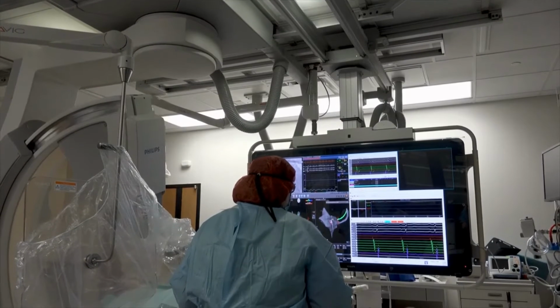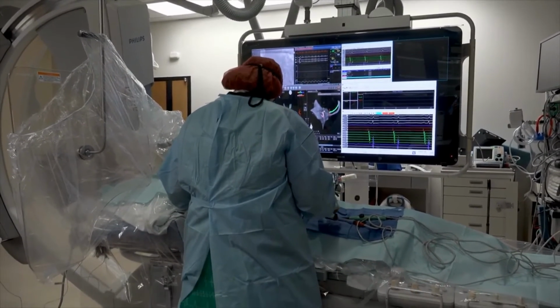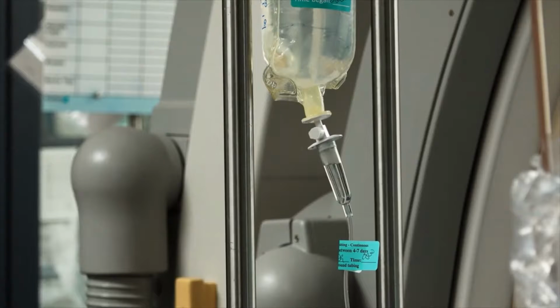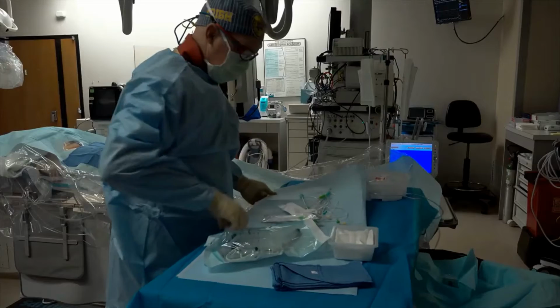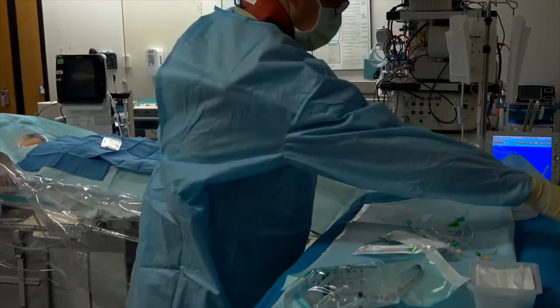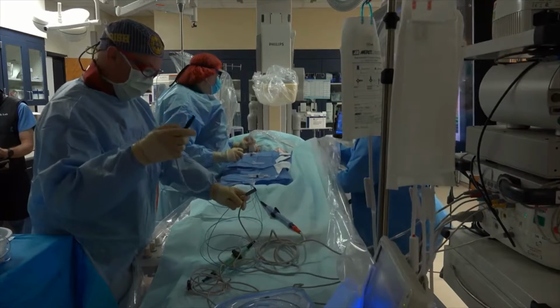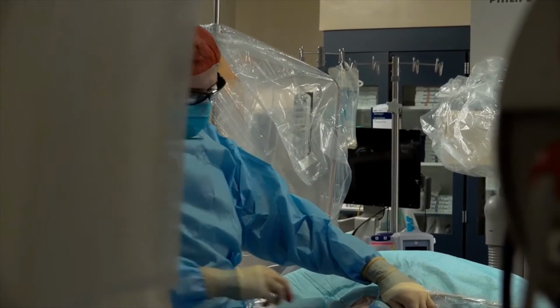The catheter ablation procedure is performed in the electrophysiology laboratory of the hospital, where you will be placed on an X-ray table. You may be given medications intravenously to sedate you or make you sleepy. These medications help reduce your anxiety and relieve your discomfort. Your groins will be cleaned with antiseptic, and sterile drapes will be placed to cover your body. A local anesthetic will be administered with a tiny needle to numb the area where the catheters are inserted. You will feel a pinprick and possibly a stinging sensation for a few seconds.